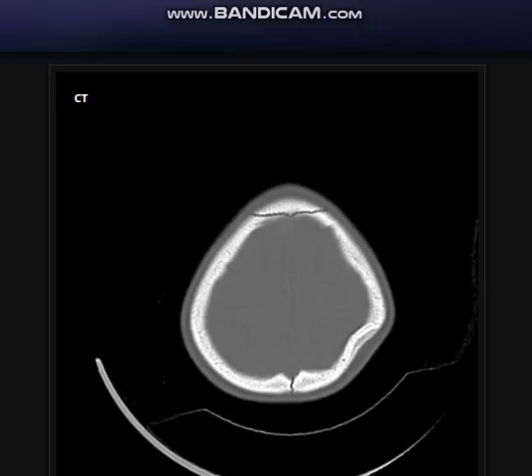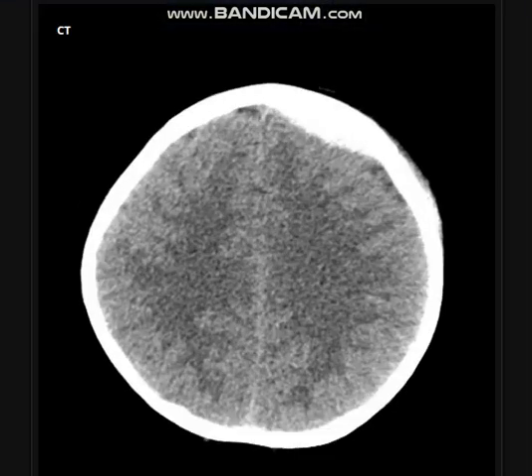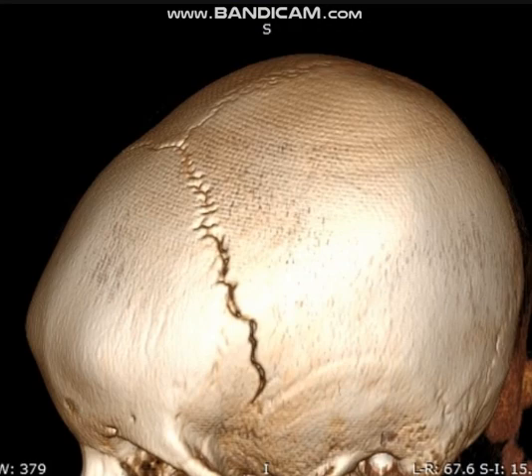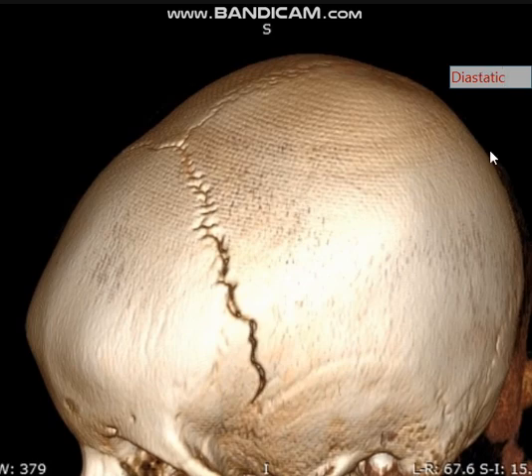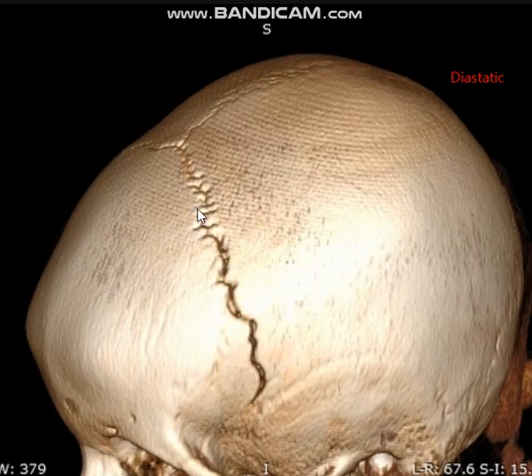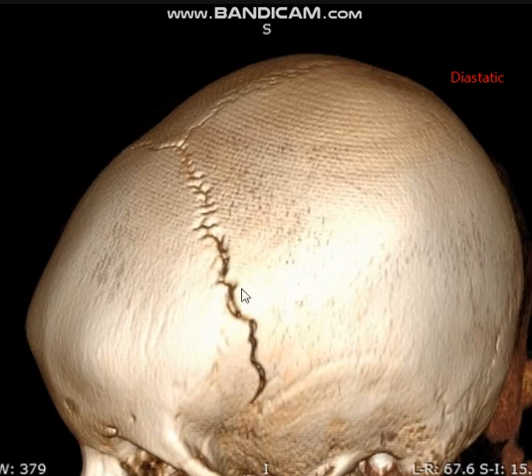The third type, which is very uncommon and almost always seen in children, is what we call a diastatic skull fracture. Here we have a young child with a history of recent trauma, and on the 3D volume rendering bone window you can see there is a diastasis of the coronal suture on one side.